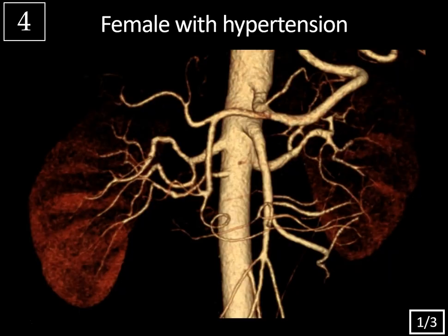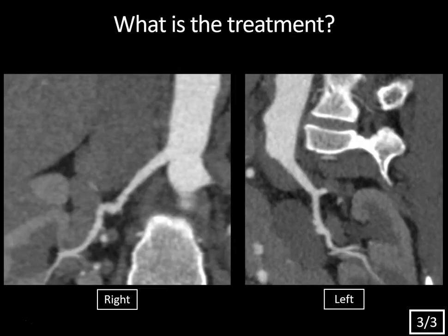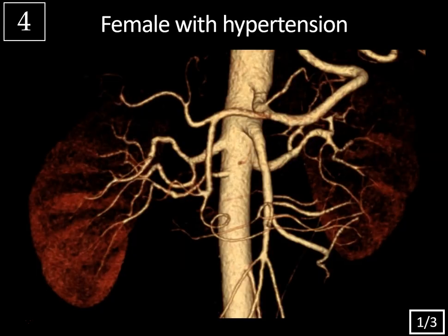Case 4: female with hypertension. This is a 3D volume rendered image of the renal arteries. You can see subtle beading of the renal artery contour, most pronounced at the mid to distal aspect of the right renal artery, with less pronounced beading on the left. Focusing in on the right renal artery, you can see that beaded contour much better with areas of intervening stenosis and dilatation. These are bilateral curved planar reformatted images of the renal arteries. What is the treatment for this condition?